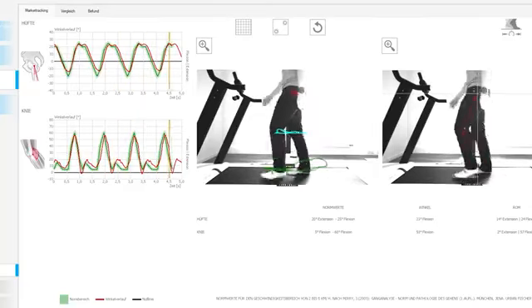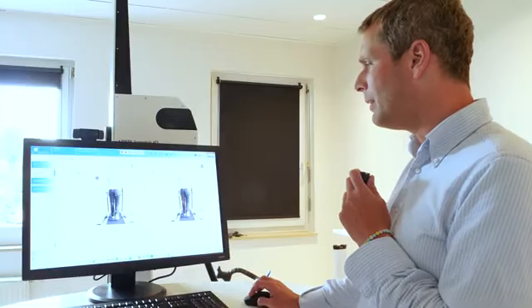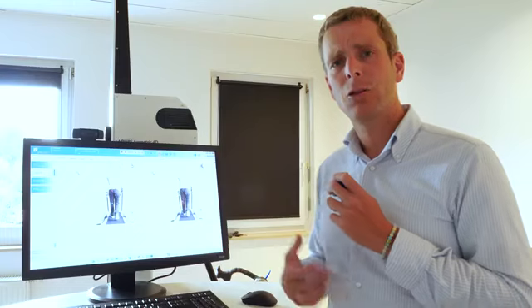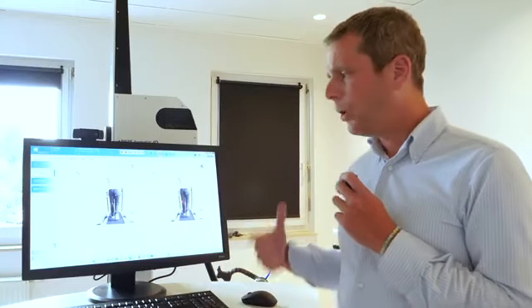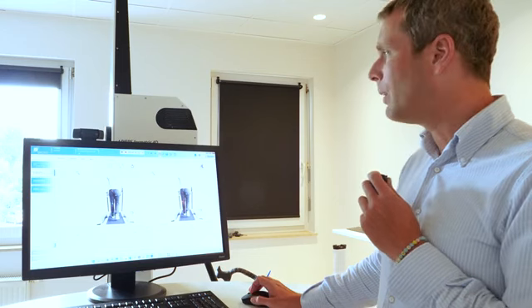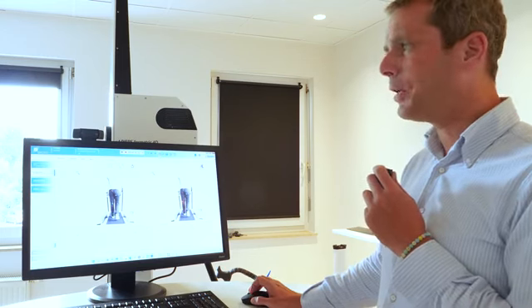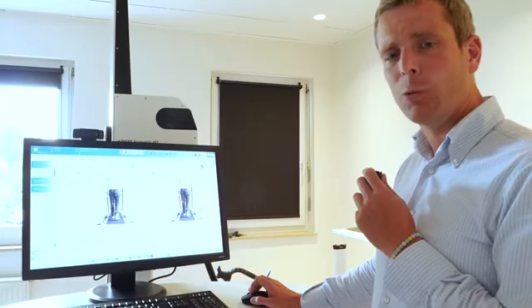We will make a separate video about that. I just wanted to show you how easily and quickly we can compare the individual measurements here. And it doesn't always have to be a complete spinal column measurement. You can also explicitly break it down to individual questions and quickly get good measurement data. In the end, as I can see here, it took 3 minutes and 50 seconds, including explanation. And from our point of view, that's extremely feasible in everyday practice.